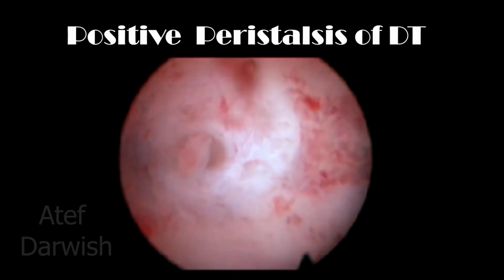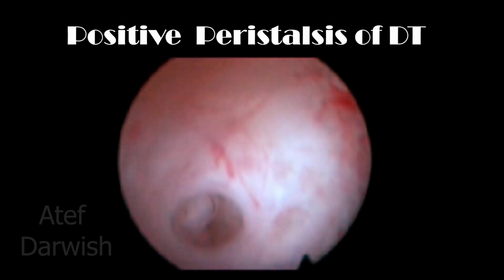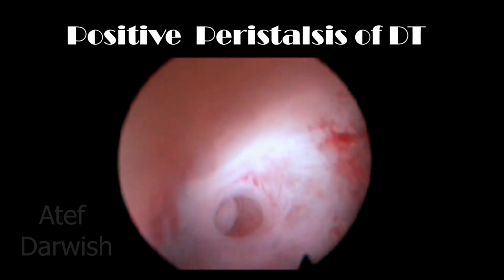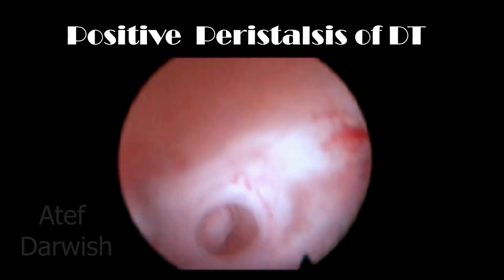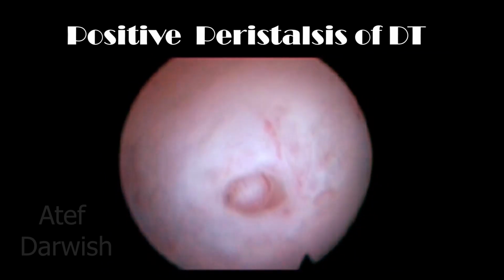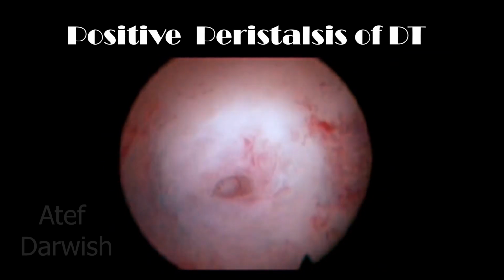In this case, positive peristalsis is present, with contractions and relaxation of the ostium and intramural part, and there is a polyp inside the Darwish triad. With frequent contractions and relaxations of the proximal part of the fallopian tube, the polyp comes outside the triad into the endometrial cavity.